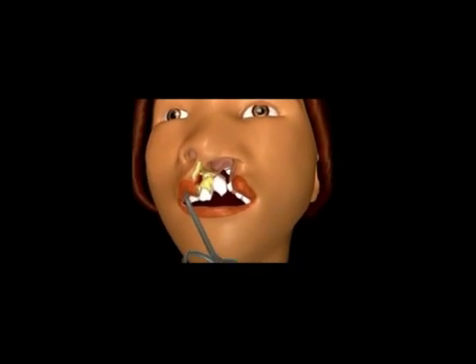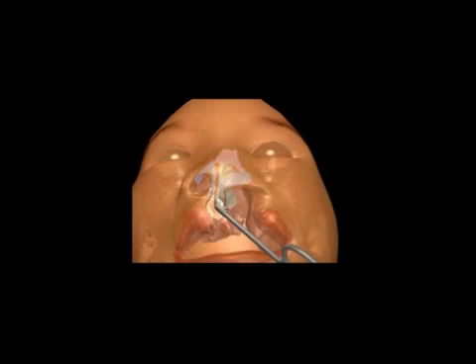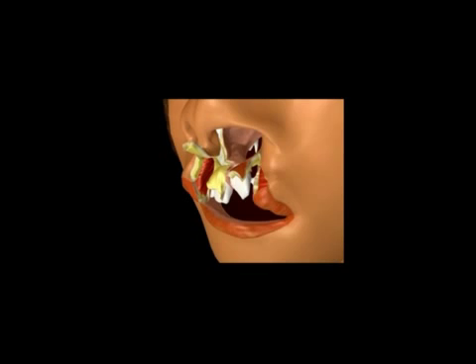Much of the principal focus of the first surgery is on repairing the nose. Here you see these scissors being inserted into one of the incisions. The idea is the skin and fat that are on top of the cartilages need to be lifted up so that the cartilages can be repositioned. Surgeons use scar tissue to get the tissue to heal together in a new, hopefully normal orientation. Here you can see after removing the skin and fat from the tops of the cartilages, we've pulled up the depressed cartilage of your child's nose into a more normal position and this will be sutured in place afterwards.